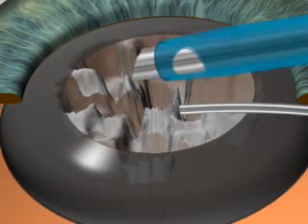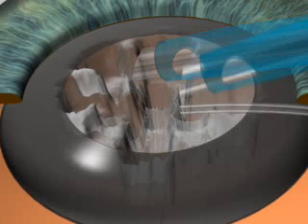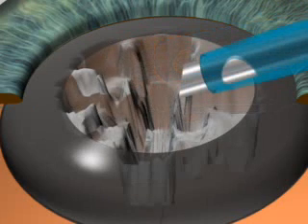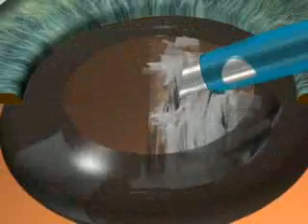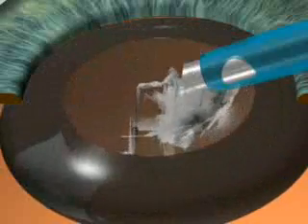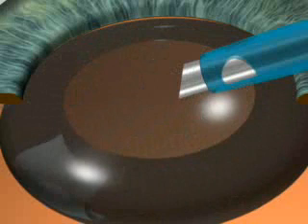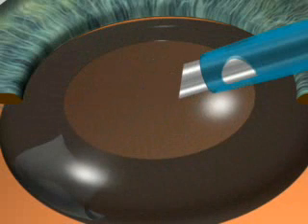The quadrants are then emulsified and aspirated one after the other. Care must be taken not to puncture the thin posterior lens capsule, since that could result in a prolapse of vitreous.